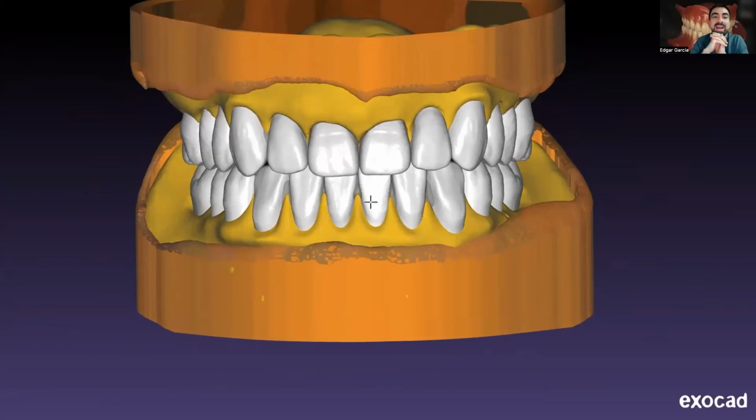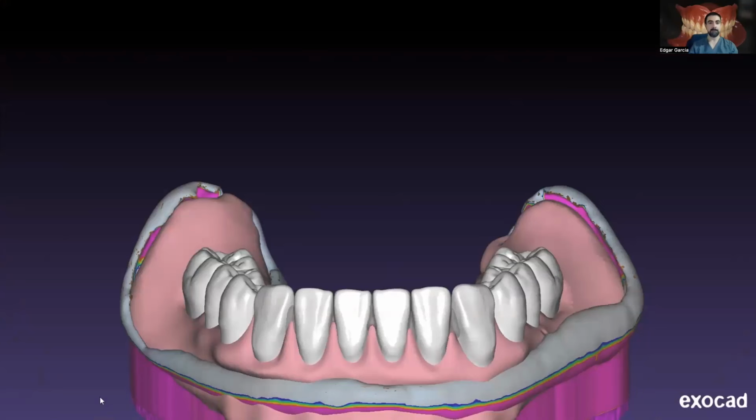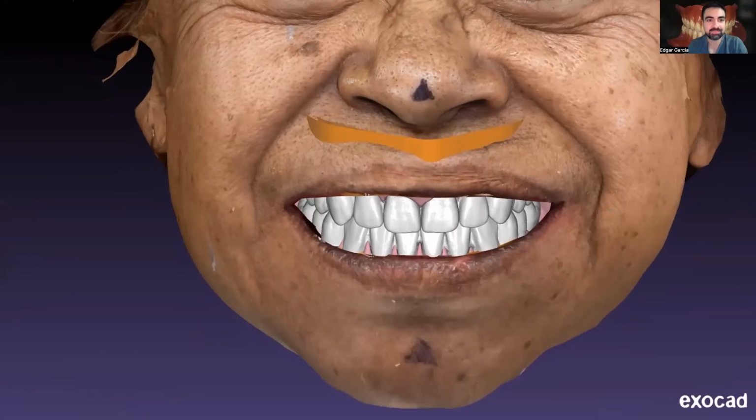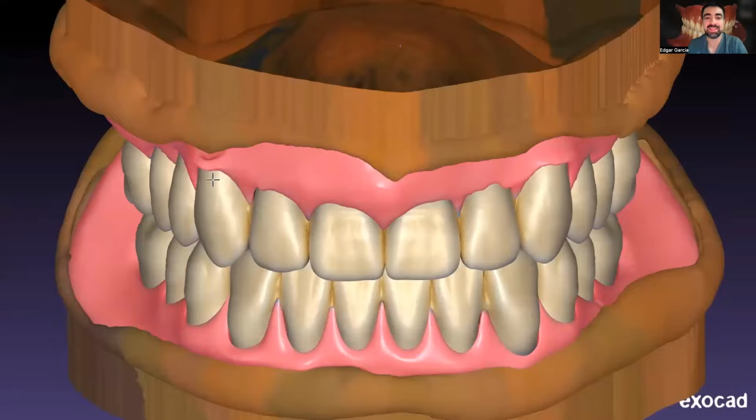Now, let me ask you a quick question. You did the alginate impression for the lower arch with the tray. Do you use the special tray also for the maxillary arch, or do you use a regular plastic tray or metal tray? A regular one. Okay, perfect. A regular, whatever you want. Regular edentulous tray. Exactly. But I call this the easier protocol.